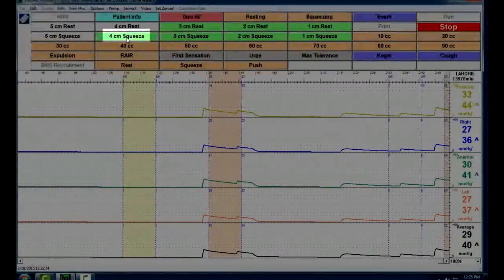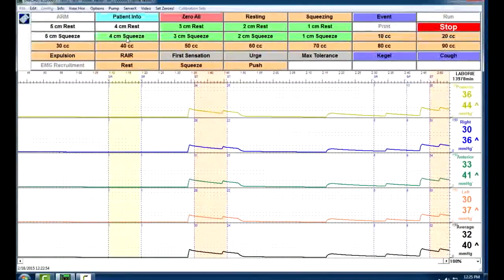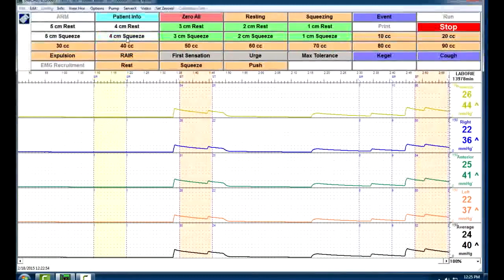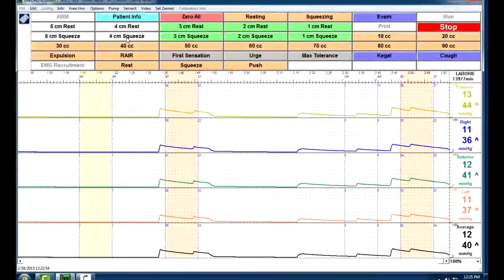Go ahead and squeeze, tighten your anus. That's it. Keep squeezing. We're going to ask them to squeeze tighter and tighter. Don't let it go. That's it. Good, good. Don't let go. And relax. And then our 10 seconds is up.